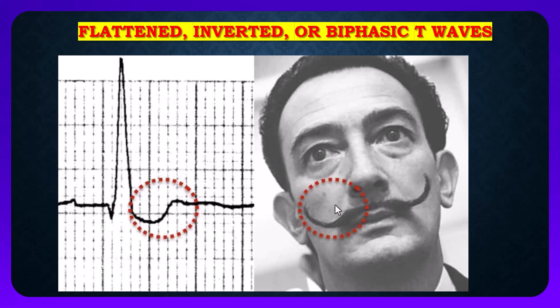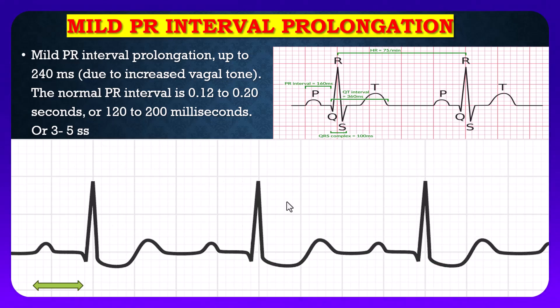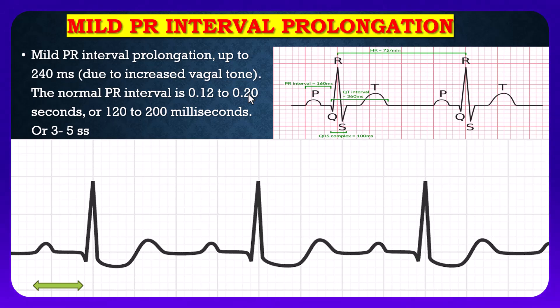The third sign or change on ECG is mild PR interval prolongation — up to 240 milliseconds — due to increased vagal tone. The normal PR interval is 0.12 to 0.20 seconds, or 120 to 200 milliseconds, or three to five small squares. Here you can see the PR interval, which starts from the beginning of the P wave to the beginning of the R wave. This interval is normally three to five small squares, but here if you count these small squares there are six, so there is a bit of prolongation of the PR interval.